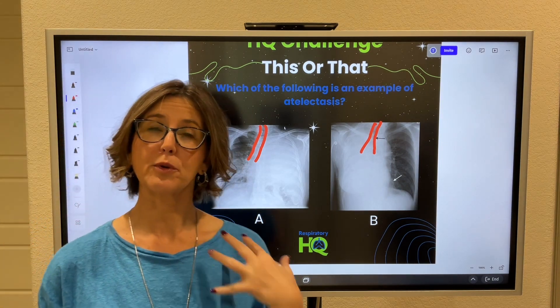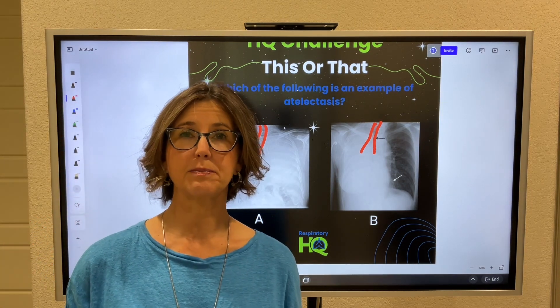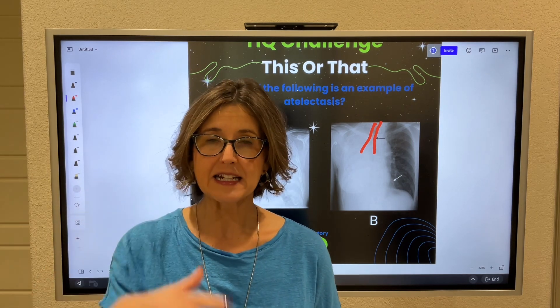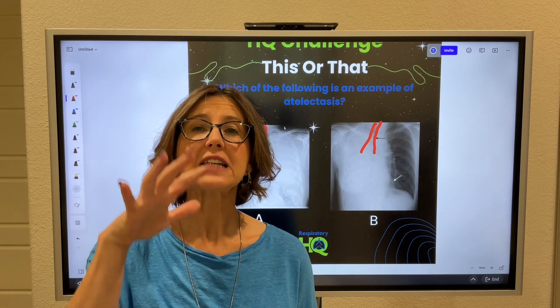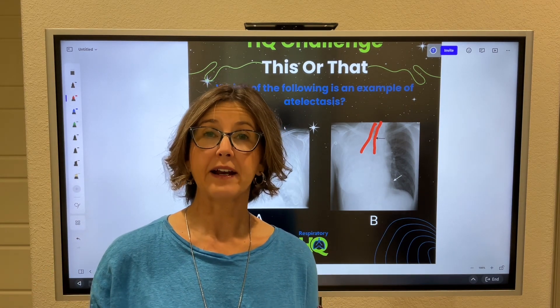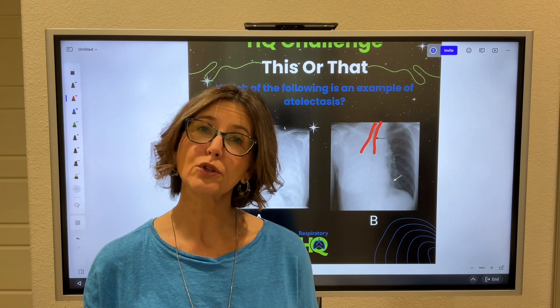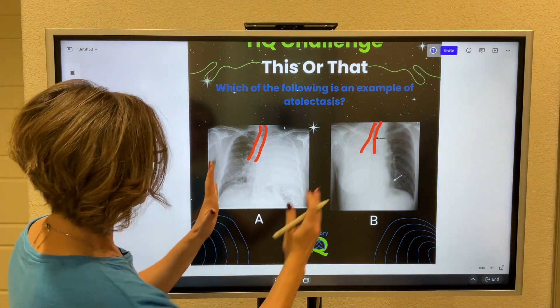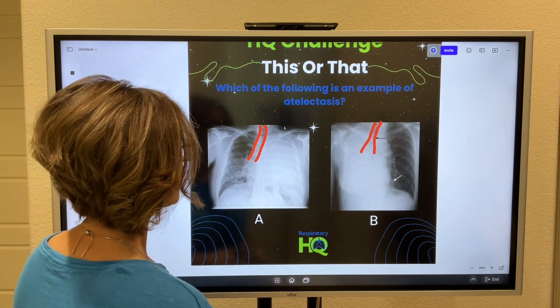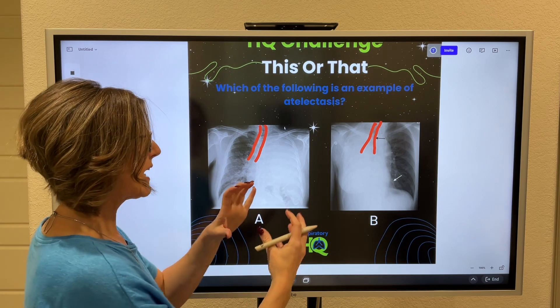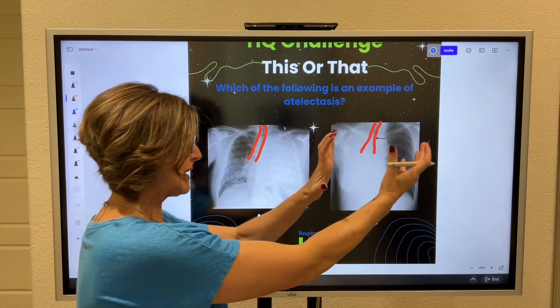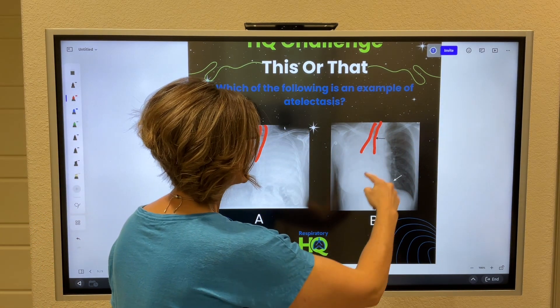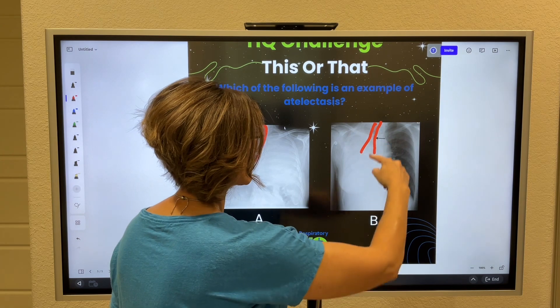From your patient assessment lectures, you remember that anything that is inside the lung — like atelectasis — pulls the trachea towards it. So now I have to say, when I look at this chest X-ray, which one is actually deviating the trachea towards the affected area? And it's this one right here.